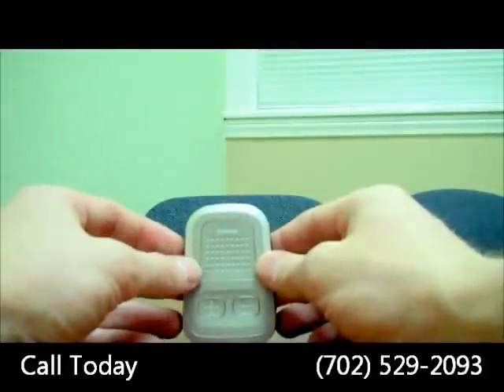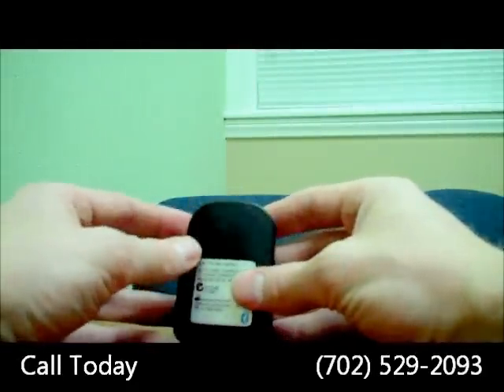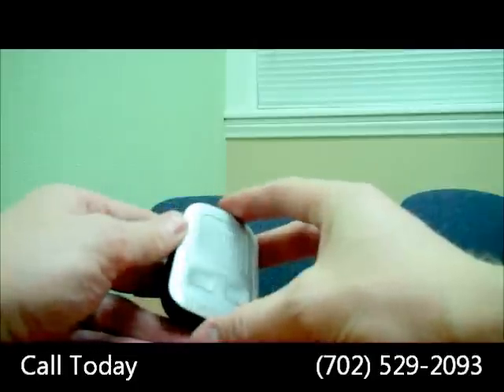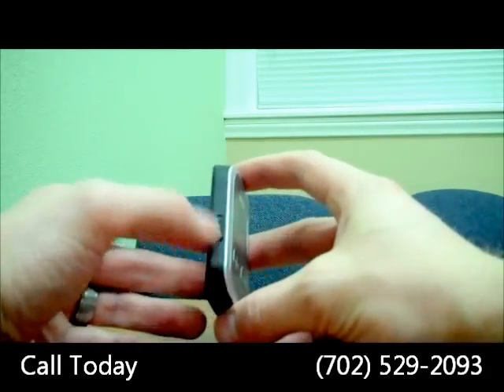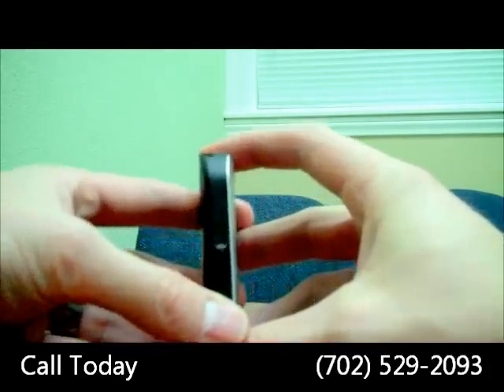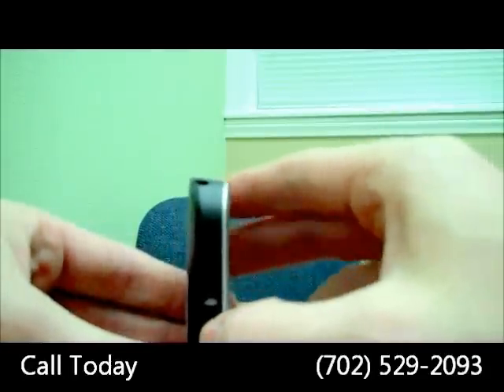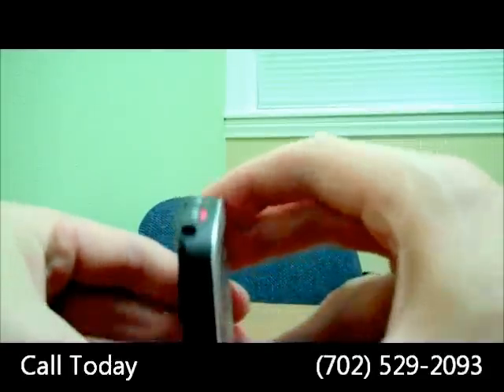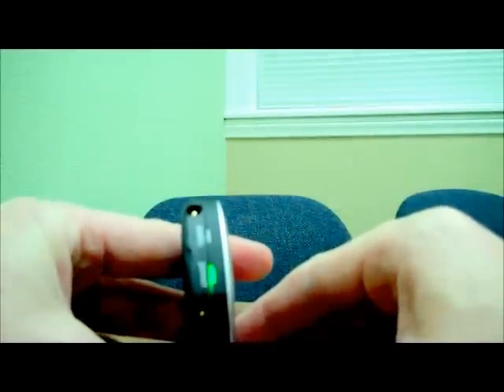So here you have the Phonak ComPilot, which is exclusively for Phonak hearing aids. Let me just go over the parts real quick. On the side here is the power switch — this is the on/off. In order to turn it on you just slide it down. That white mark is 'on.' When you turn it on or off you'll see the lights on the top flash — you see the red there meaning it's off, and then we turn it on, it goes green.